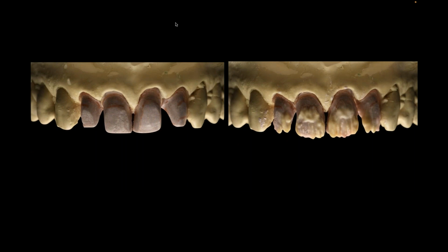So I started this case with some opacious type materials, and in this case, I actually used effect chroma materials. So the yellow you see there to the left of your screen is my effect chroma 1, which is a very whitish material. And you'll notice I put that in the center of the tooth and up and down my line angles. So that's for my internal structure.